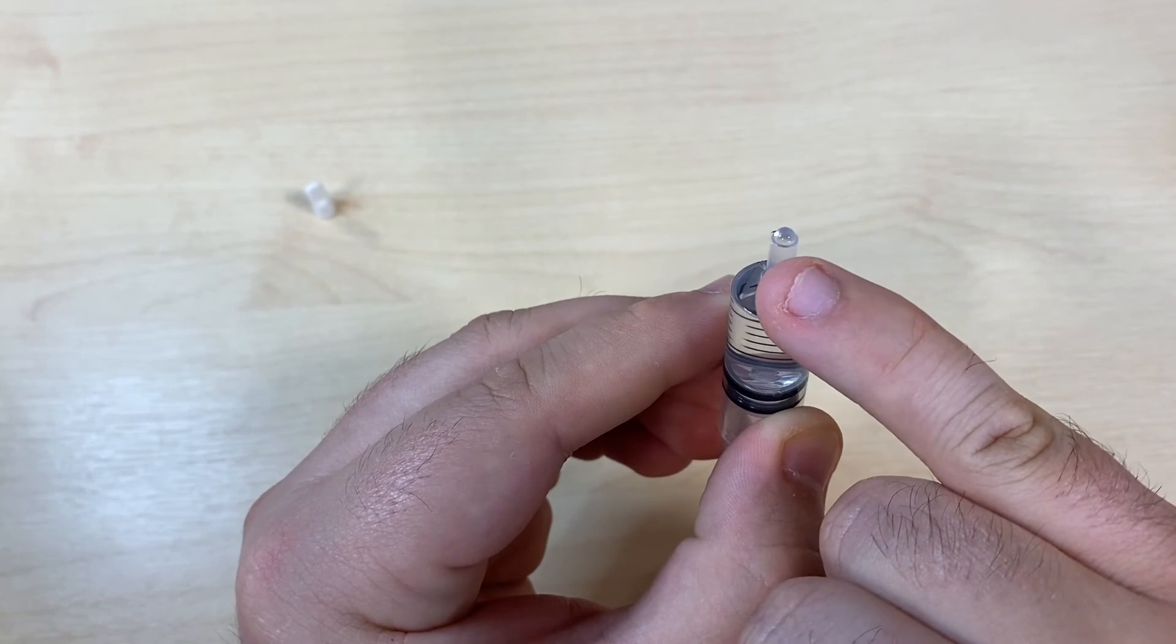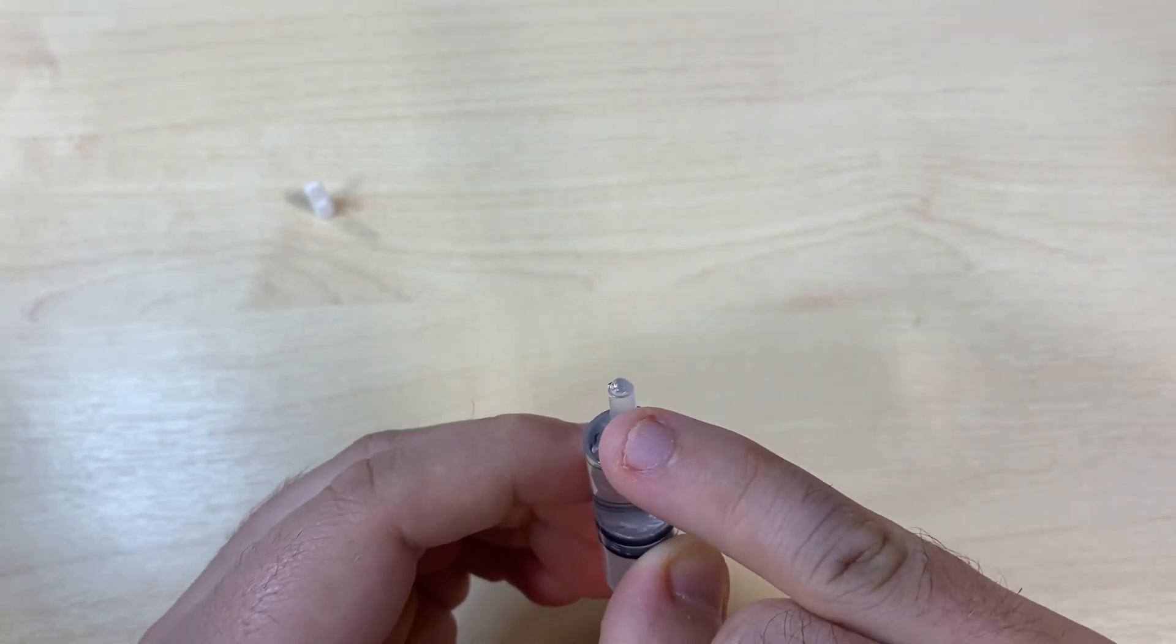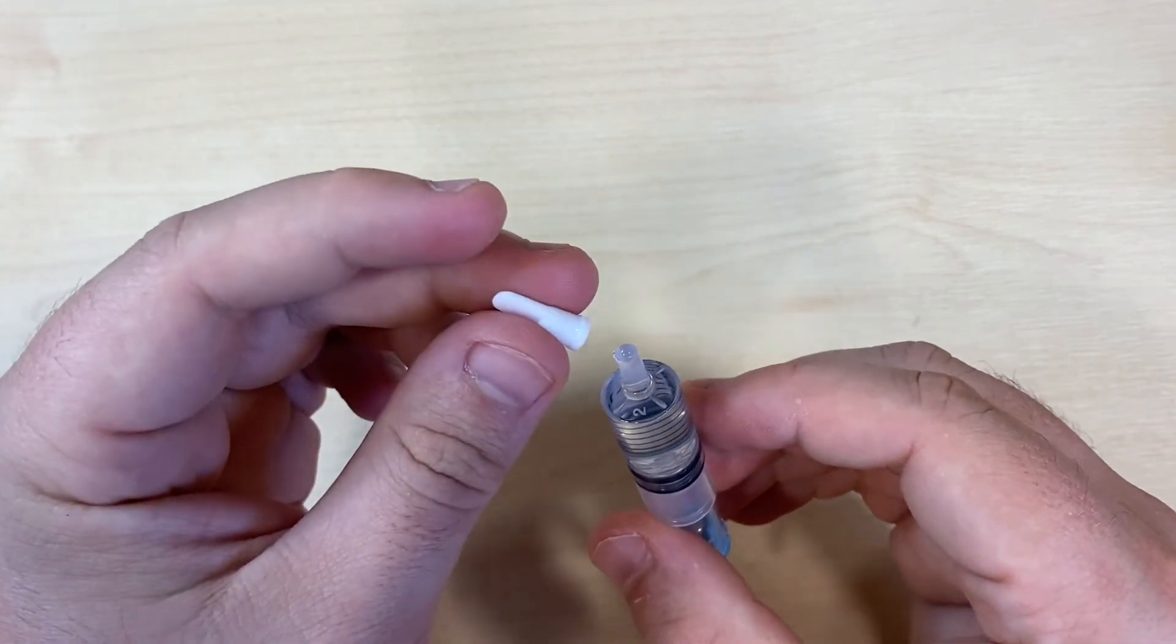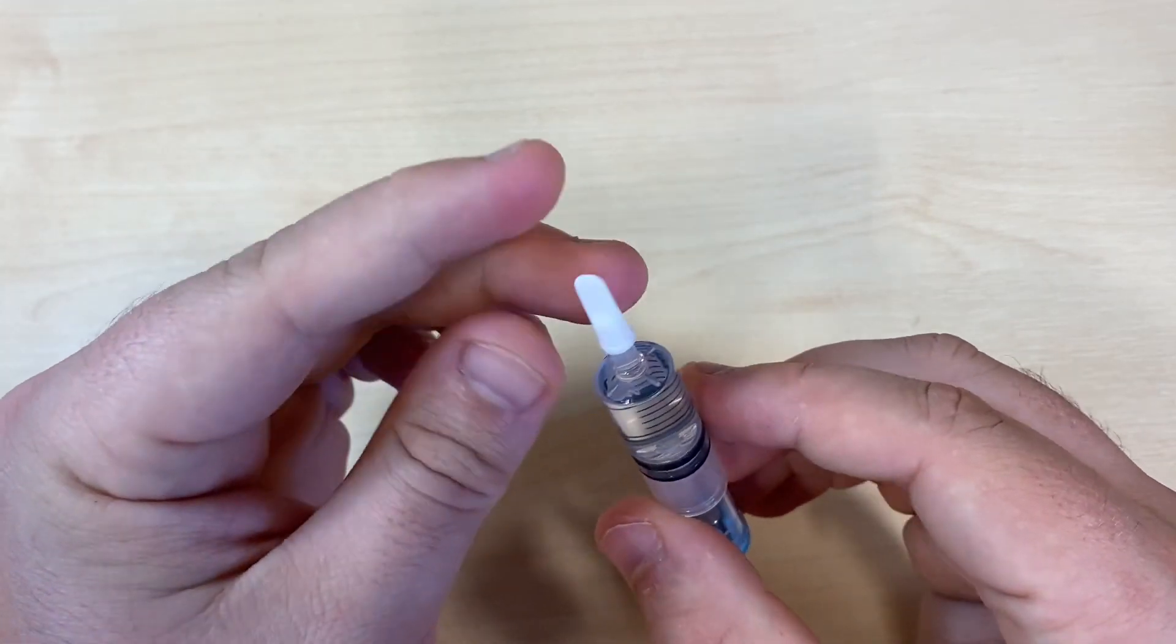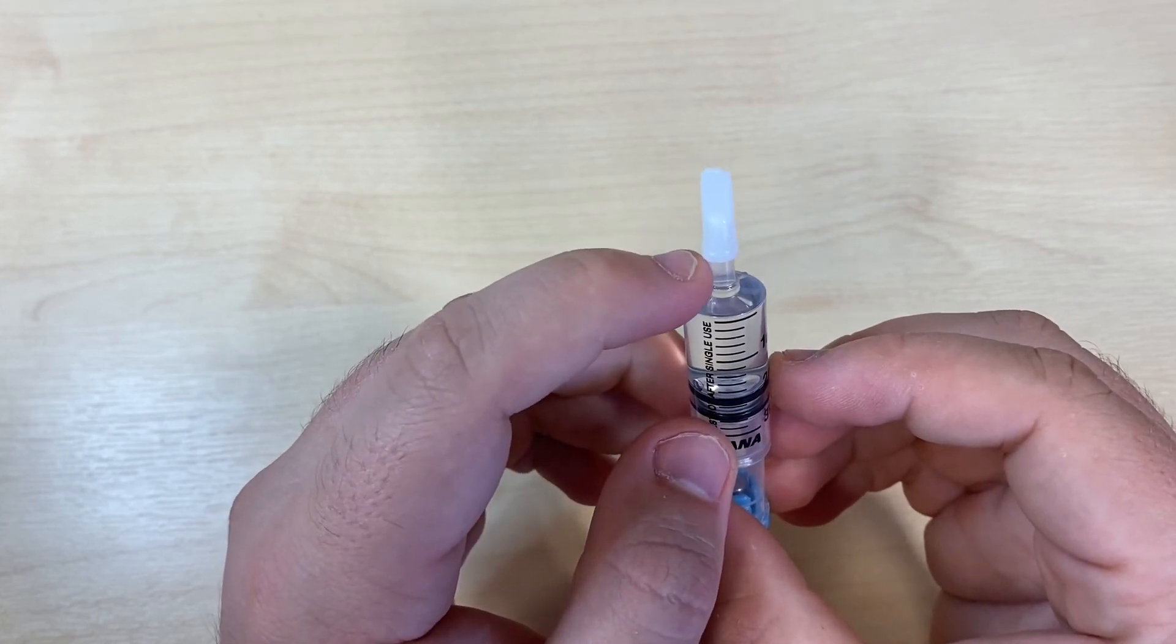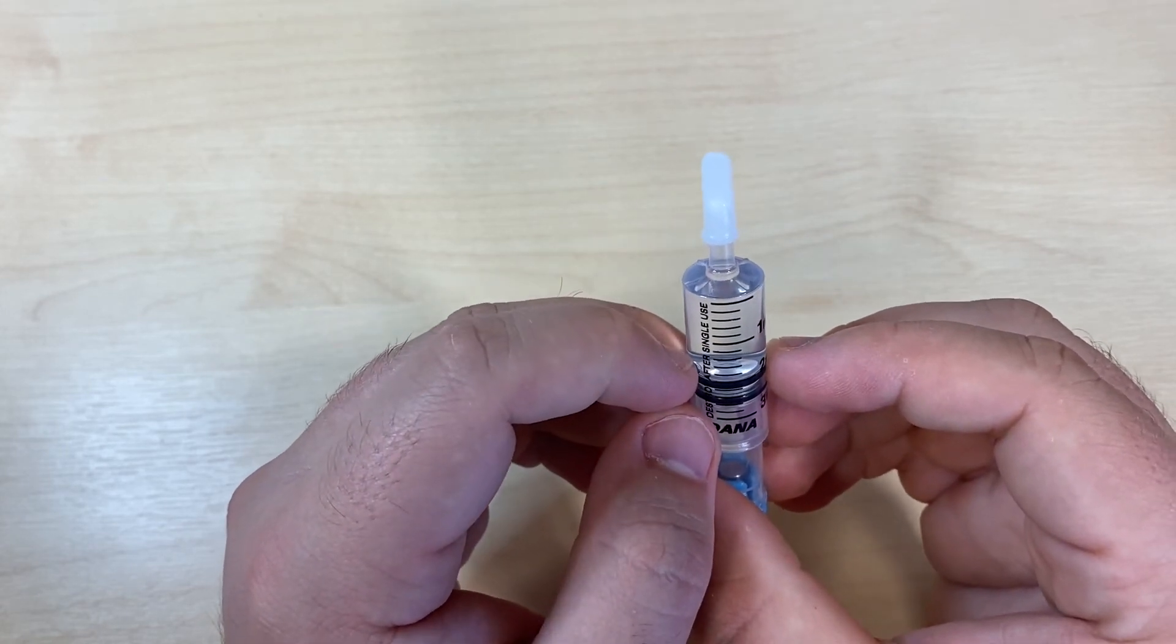You should be able to see a nice dome of insulin at the top of the neck. Retrieve your white cartridge cover from earlier and very gently place it on top, just enough so that it grips. If you push this on with too much force, you'll push air into the neck and need to get rid of that before you go through to the prime.